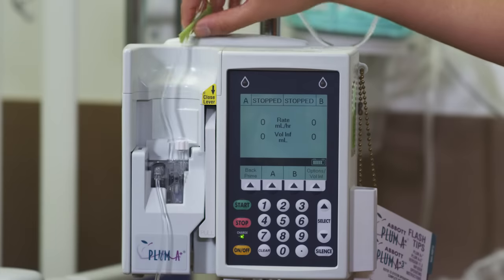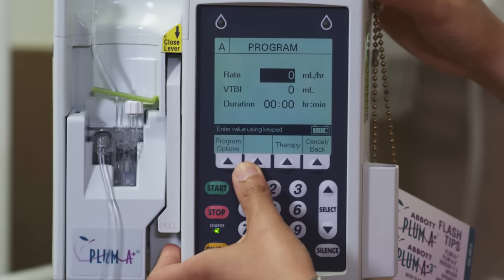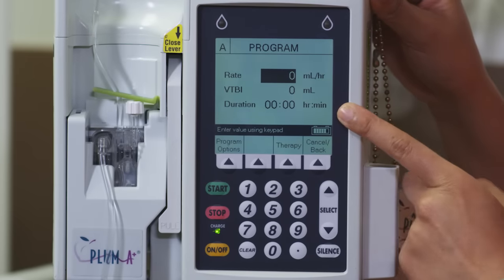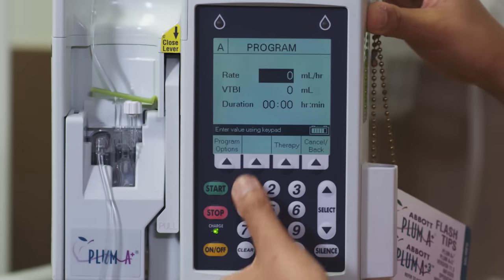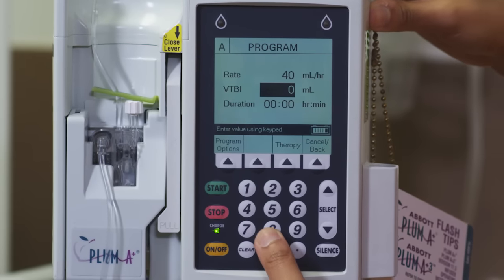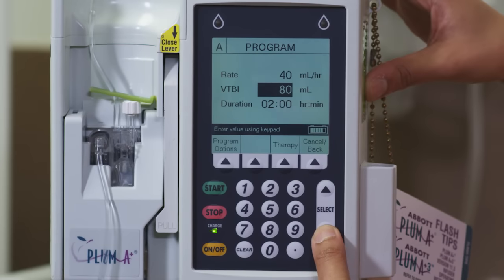So I think we're ready to program our pump. Now that we've connected the tubing to our patient, we're ready to program our primary line. Pick channel A, and you'll see three variables: rate, volume to be infused, and duration. You only need to put two variables in, and the machine calculates the third for you. We'll set our rate at 40 mils per hour, then go down to VTBI — volume to be infused. In the pediatric world, we want it set to a two-hour maximum, so that's 80 mils. You can see how the duration is already calculated for you.